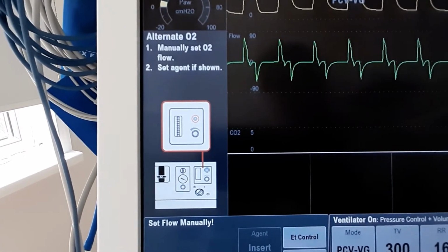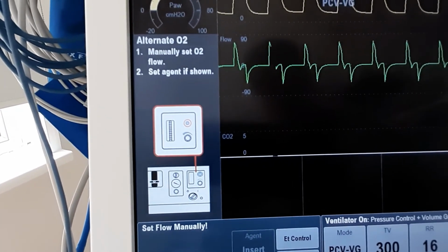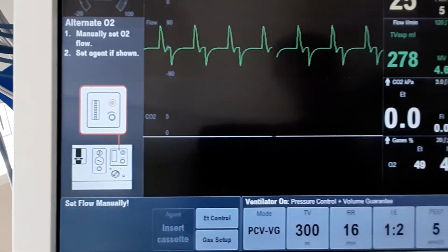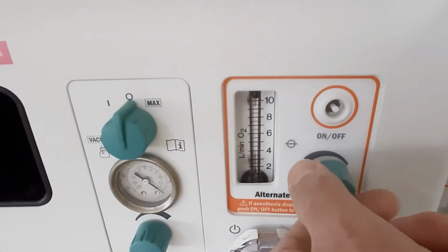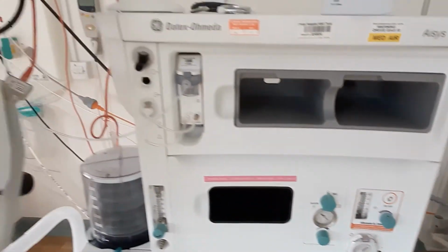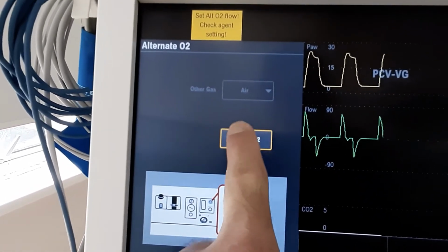We'll now need to attach the patient to a different ventilator, for example an oxylog, and check the anaesthetic machine. If you have pressed the button by mistake, this is easy to reverse. You just press the button again and close the flow meter. Following this, you need to confirm this on the screen by pressing the end alternate oxygen control.